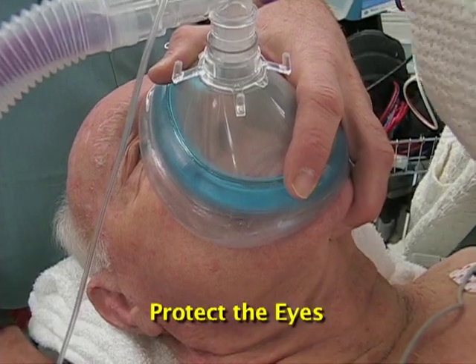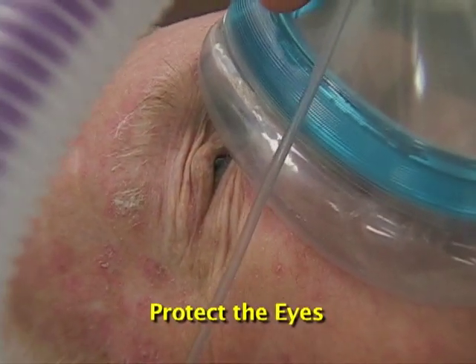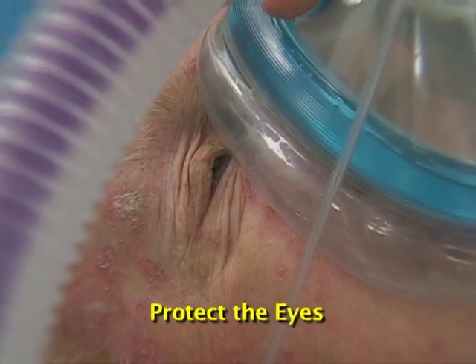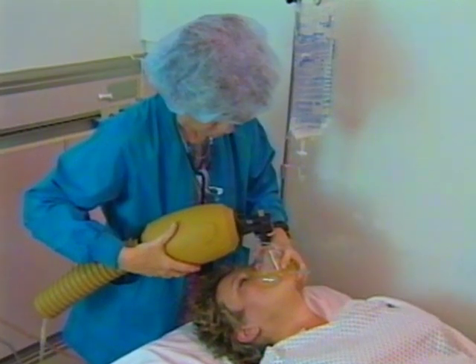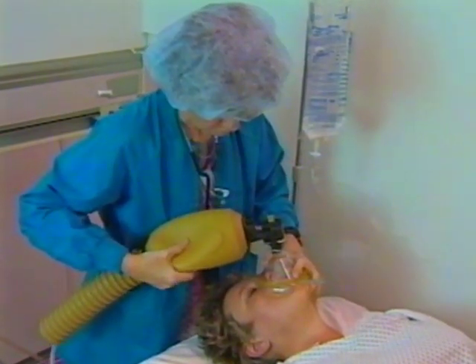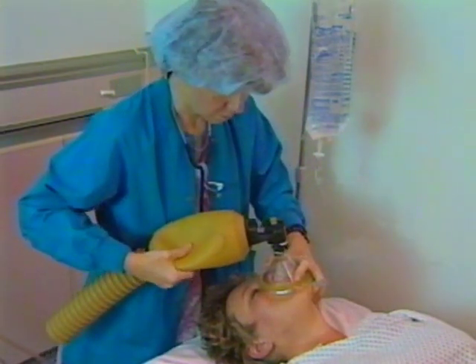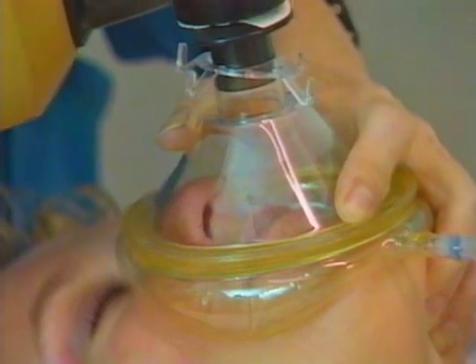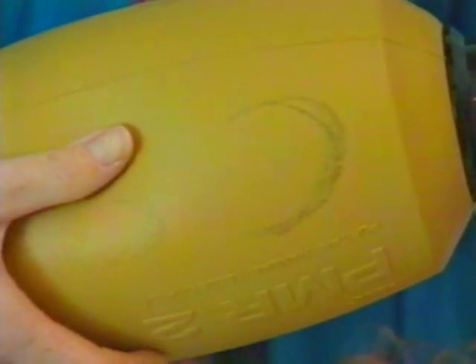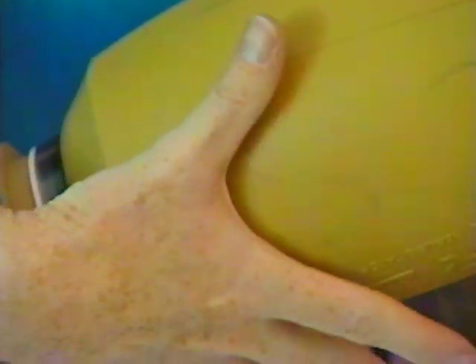Protect the eyes. It's easy for the mask to push open the eyelids, exposing the eyes to corneal abrasion. Consider taping them closed if the patient is unconscious. To ventilate, squeeze the bag. The chest should rise with each breath. Pay attention to the resistance you feel as the lungs inflate. Obstruction makes squeezing the bag more difficult, whereas a leak in the ventilation system makes squeezing the bag very easy. In both these cases, however, the chest won't rise well.